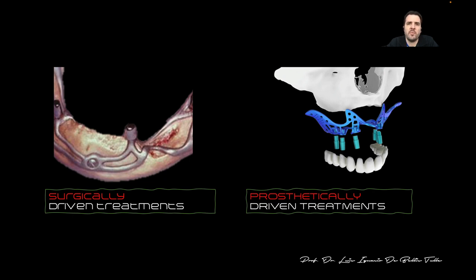Clinicians opened and placed implants where they found bone. Nowadays, we do not do that. We take CBCTs, we do all our virtual plannings, and we place implants where we really need those implants, because nowadays our treatments are prosthetically driven treatments. And that has been a great improvement thanks to technology.